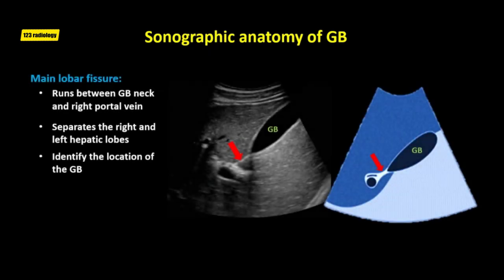The gallbladder neck has a constant relationship to the main lobar fissure and the portal vein. The main lobar fissure connects the right portal vein to the gallbladder neck, and the fissure can be traced between these two anatomical structures. This makes the fissure a useful landmark for locating a small contracted gallbladder or a gallbladder that is completely filled with stones.